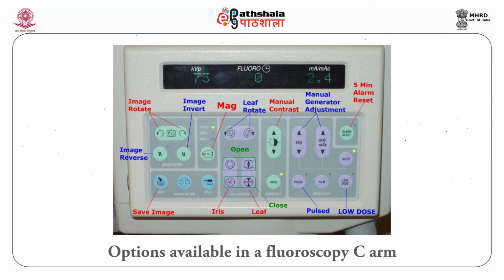However, one should justify the use of magnification mode. Use of magnification mode increases the radiation dose imparted to the patient. Now, there is also a collimator. You can either open the collimator wide or collimate it tightly.